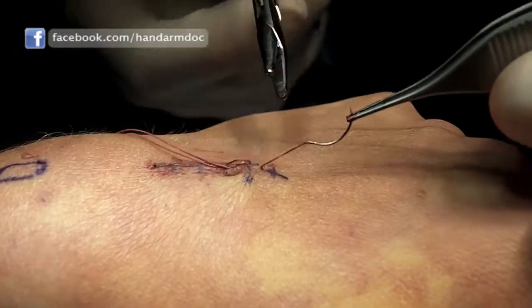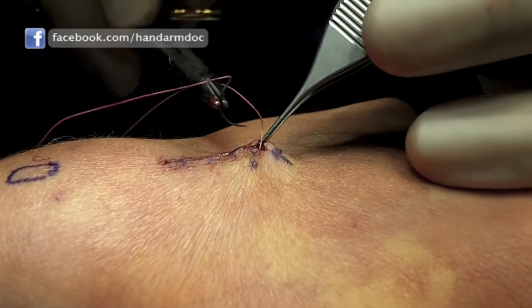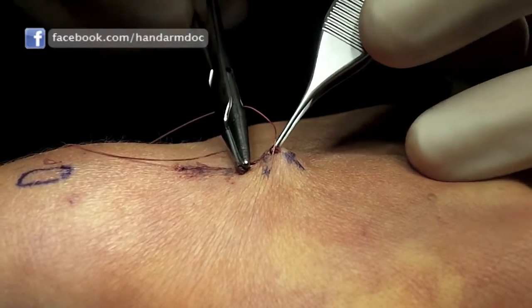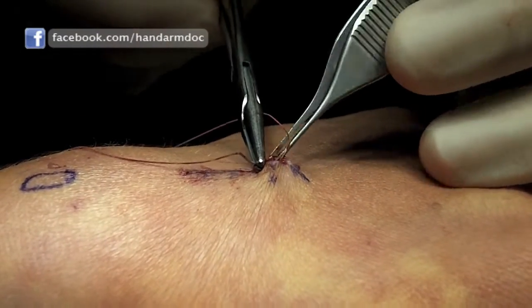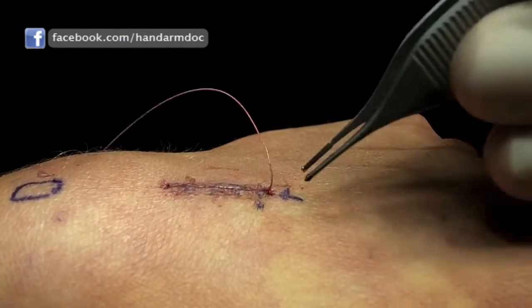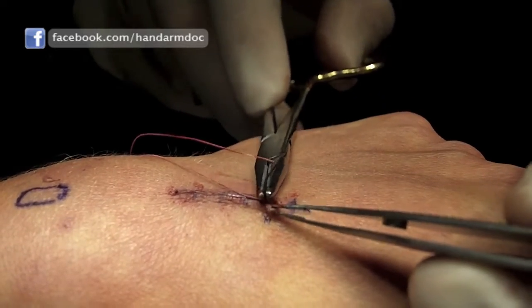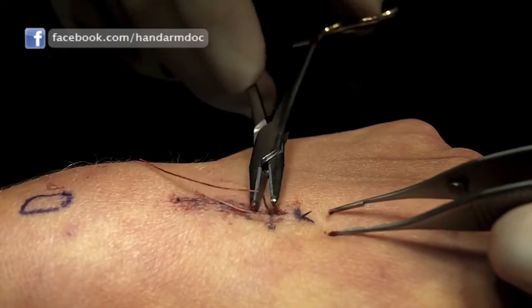The friction between the suture and the dermis keeps the suture in place and keeps the skin from coming apart. I usually lock the suture one or two times along the way, which forms a strong anchor for the suture without creating a big knot. The end of the suture is cut and allowed to retract beneath the skin.